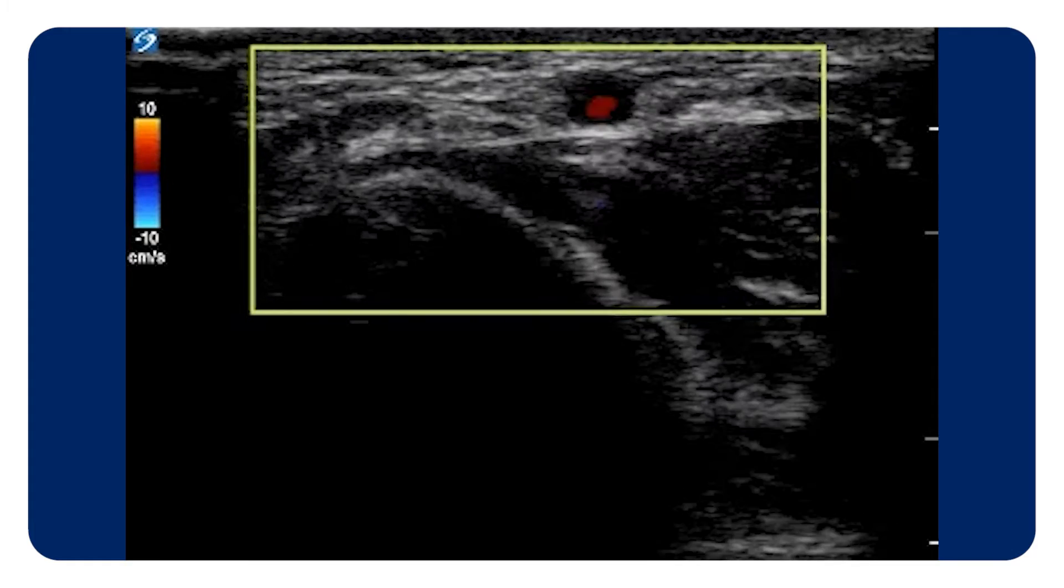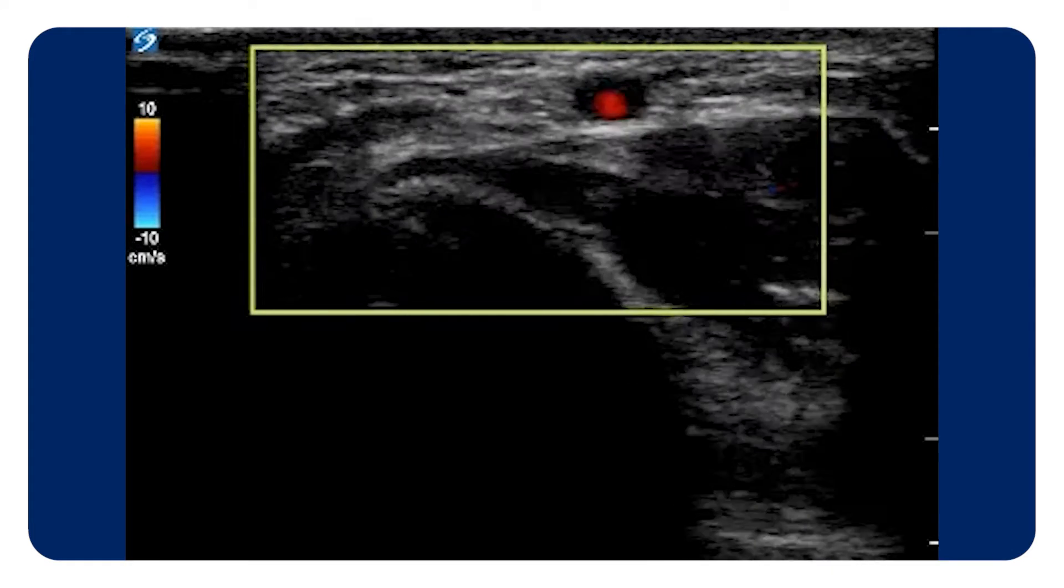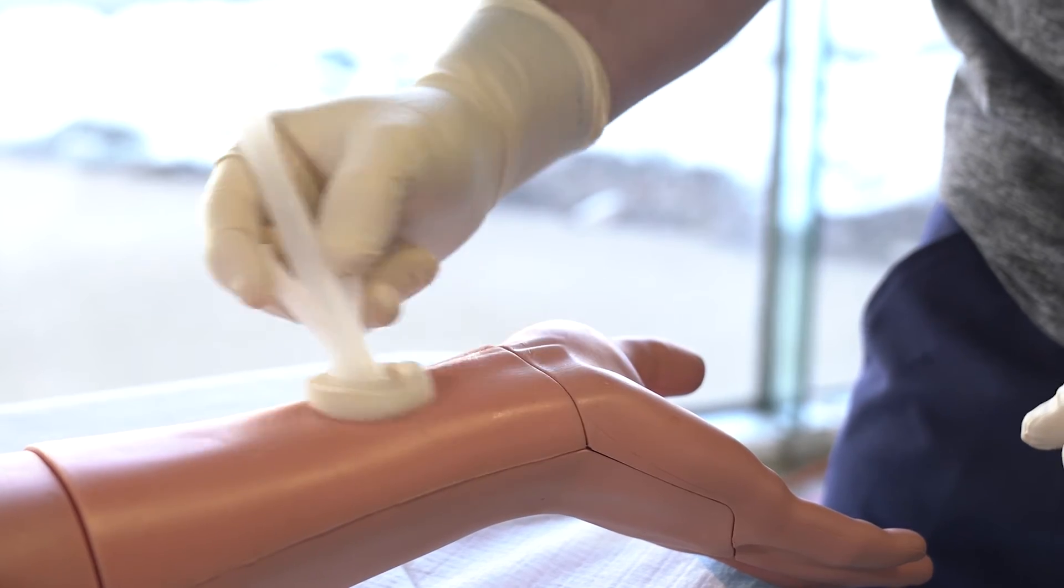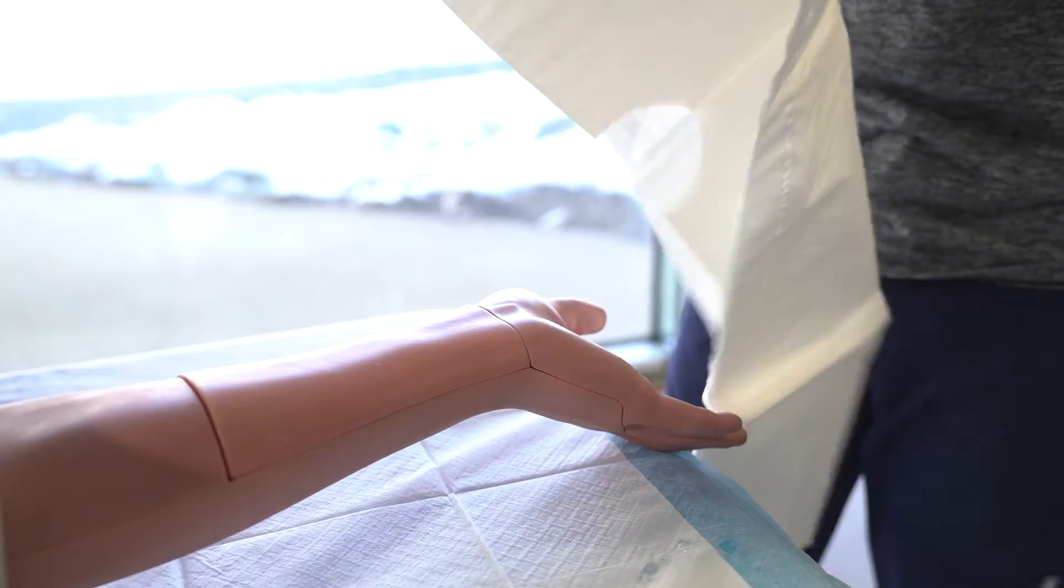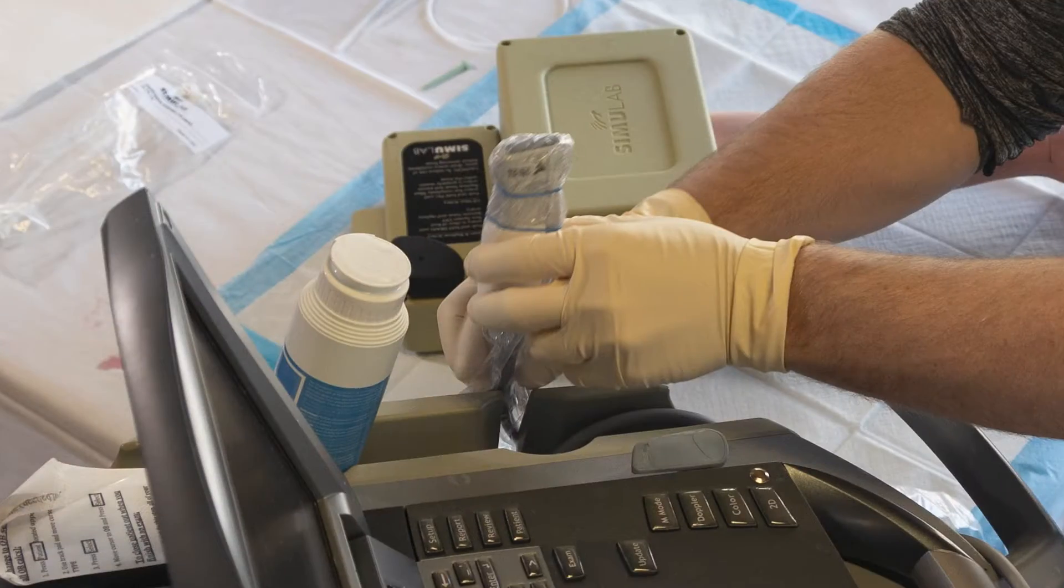Appropriately position the patient and identify the vessel of choice under ultrasound guidance. Clean the site with chlorhexidine and apply sterile drapes in appropriate fashion for the vessel being accessed.